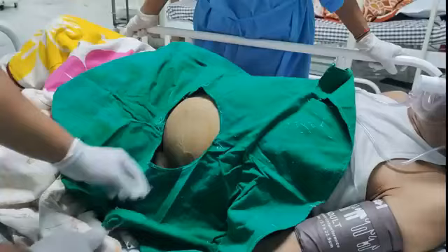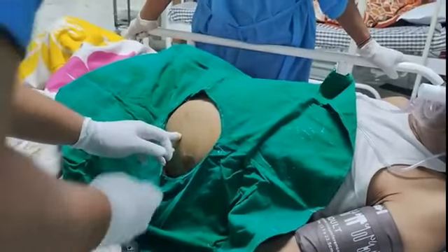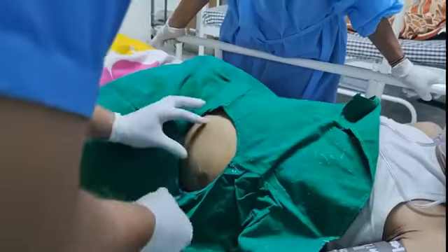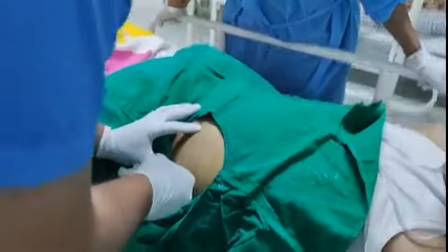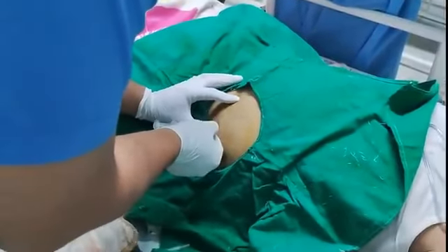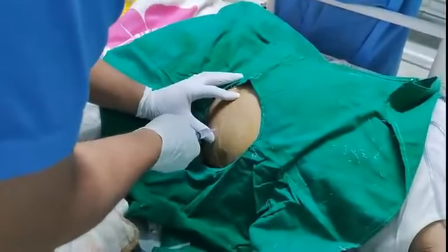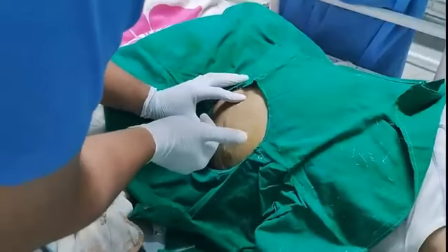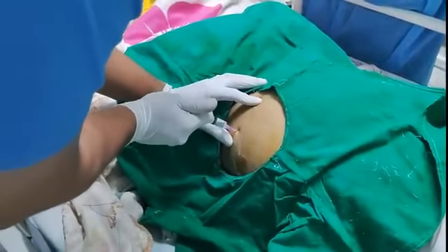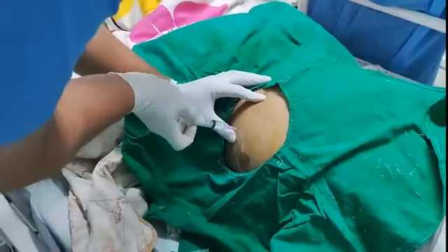Using a 25-gauge needle, place a wheal of local anesthetic over the insertion point. Switch to a larger, 20 or 22 gauge, needle and inject anesthetic progressively deeper until reaching the peritoneum, which should also be infiltrated because it is sensitive. When the needle is advanced, maintain constant negative pressure to ensure lidocaine is not injected into a blood vessel.